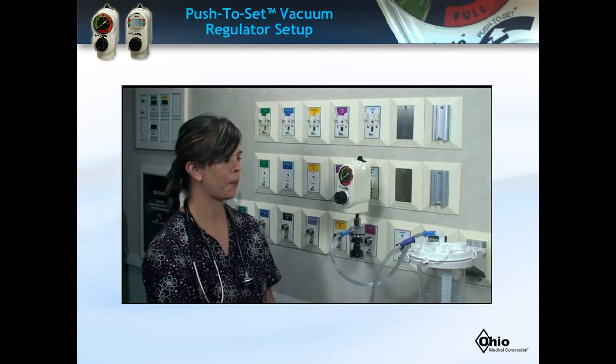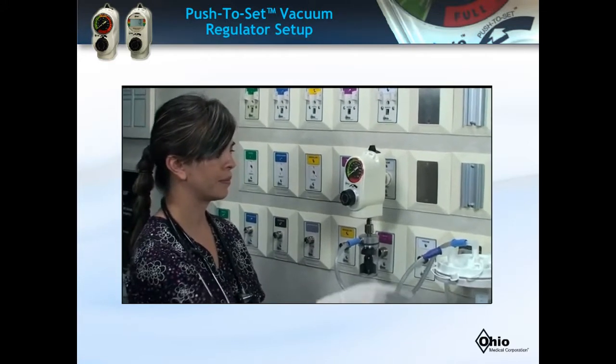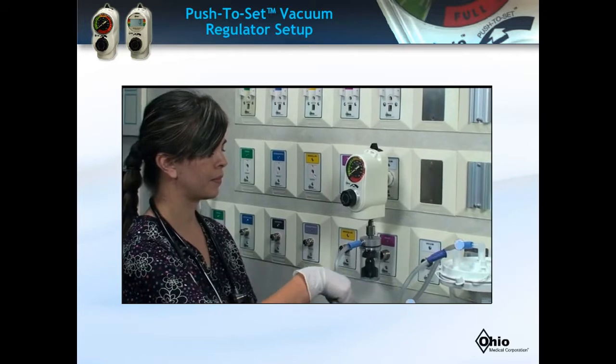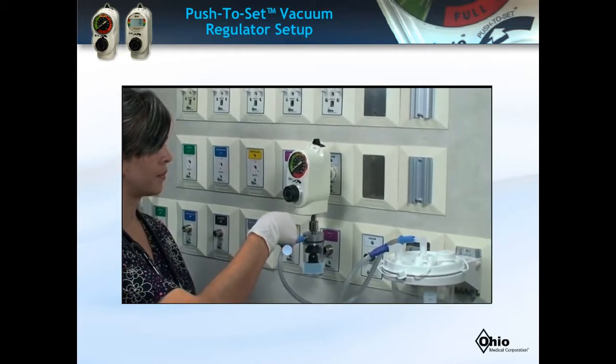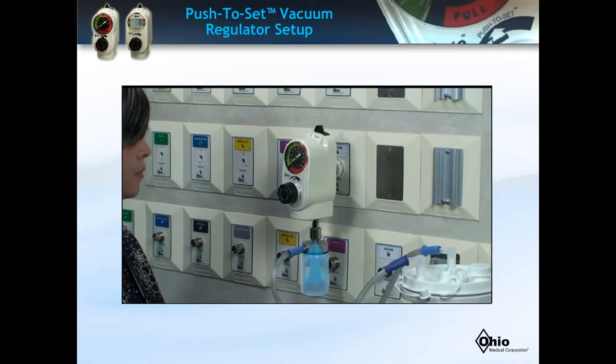The overflow safety trap acts as a redundant safety feature if the automatic shutoff valve in the suction canister should fail. Fluid will flow to the trap and the missile-like structure inside the trap will rise and shut off the vacuum from the regulator. Please follow hospital protocol for cleaning of the trap.